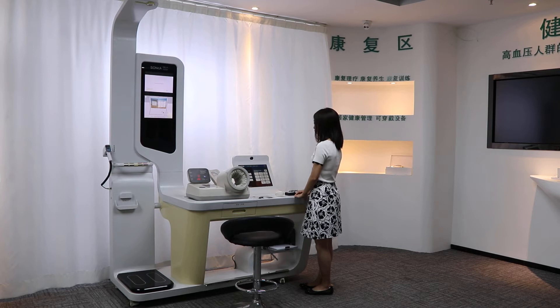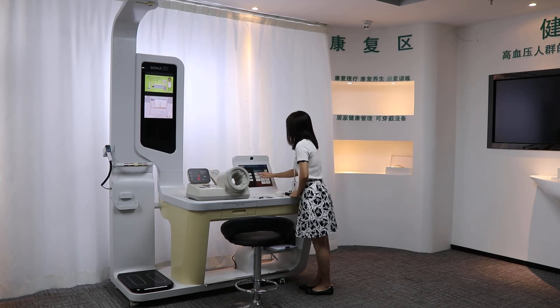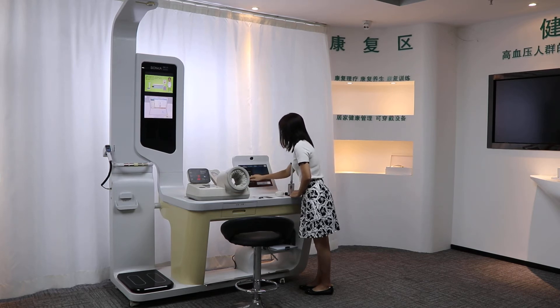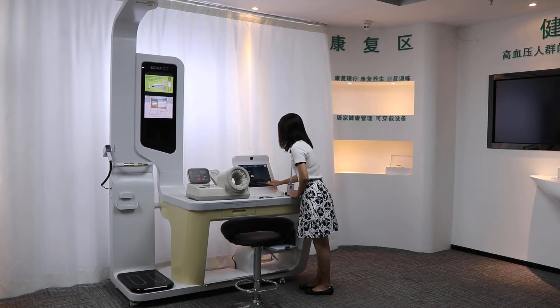Now we have a demonstration and we log in by mobile phone number. The person chooses their name, writes their name, chooses their gender and inputs their age, then logs in.